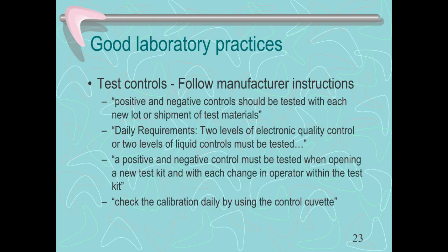So other good laboratory practice, being sure that you're using your test controls based on what the manufacturer tells you. Positive and negative controls should be tested with each new lot or shipment. So every time you open a new box, you need to do your testing. Or you may have daily requirements. Some require controls with each specific testing.